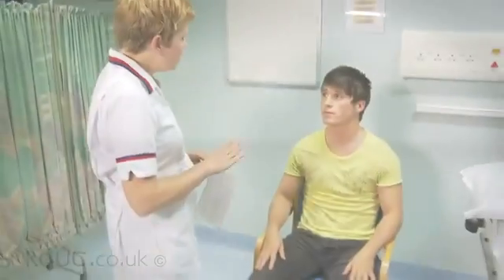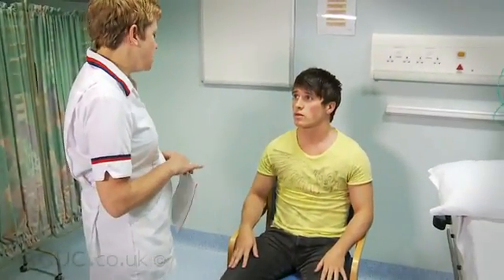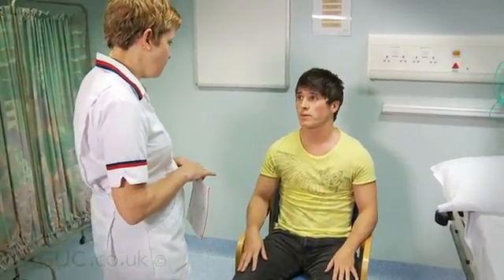Before commencing the test, briefly explain the procedure to the patient and gain informed consent verbally.